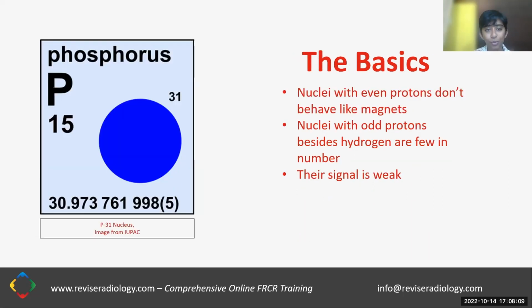Yeah, you might ask at this point, what about the electrons in the body? Don't they contribute to MRI at all? The answer is no, and I'll explain why a little later once we discuss what a radio frequency signal is and how it's related. So it has something to do with the way that the proton and the electron spin differently. I'll come to that in just a bit. So these are the basics. This is the basic actor in the play of the MRI. And if you have any questions at this point, you can put them in the chat. Otherwise, I'll keep going.